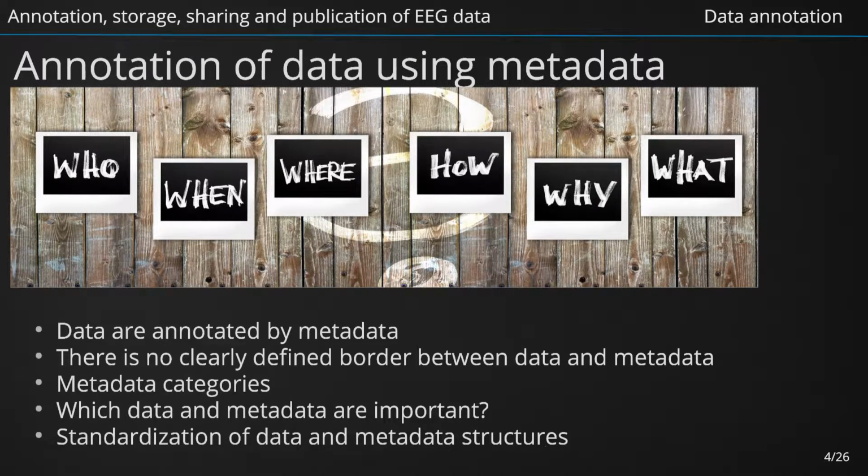The structure in which these data are stored, commonly binary data representation, is described by structural metadata. Descriptive metadata contain information about any step of data processing, typically data acquisition and analysis, and provide knowledge necessary to provide a correct data interpretation. Descriptive metadata are, for example, the number of electrodes, electrode impedance, event timestamps, and age and gender of a tested subject. Nevertheless, there are also metadata related to the whole experiment, for example, environmental conditions, which are important for the broader context interpretation of the recording.